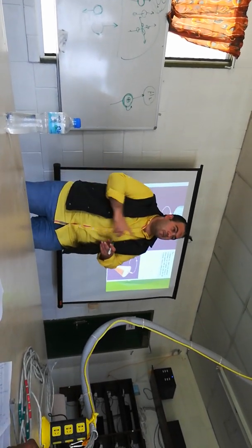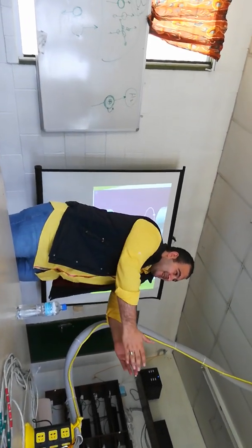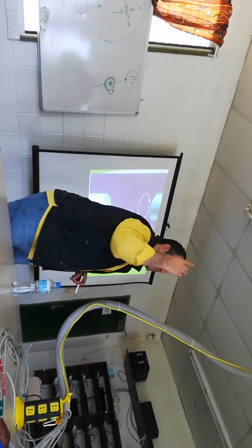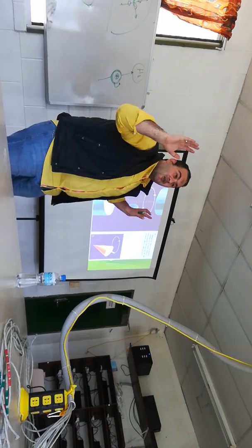Yes. So when we put the patient inside the MRI machine, what happened? The protons aligned with the magnetic field and start to precess. And the speed of precession depends on the external magnetic field. Okay?